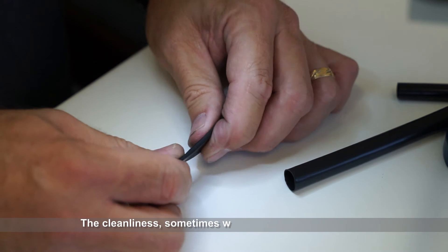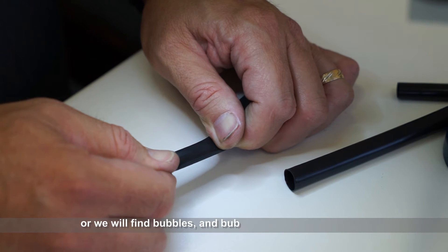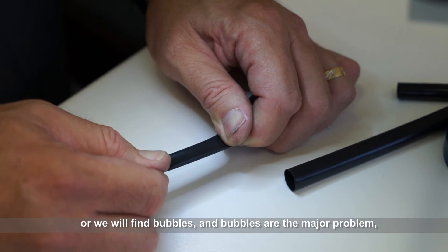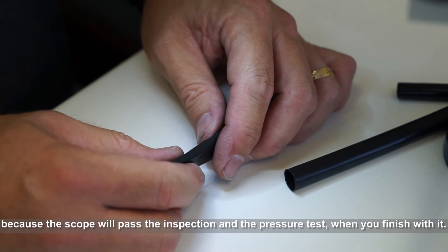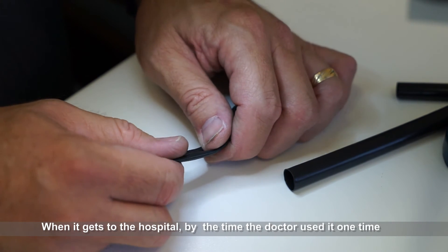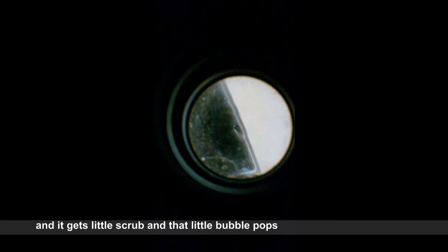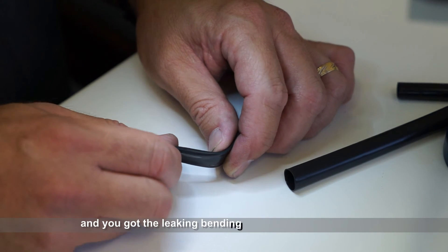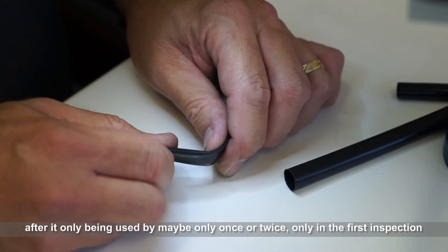The cleanliness of it. Sometimes you'll find contaminants in it or you'll find bubbles. Bubbles are a major problem because the scope will pass inspection and the pressure test when you're finished with it. You'll get to the hospital and by the time the doctor uses it one time, it gets a little scrub and that little bubble pops and then you've got a leaking bending rubber, after only being used maybe once or twice.